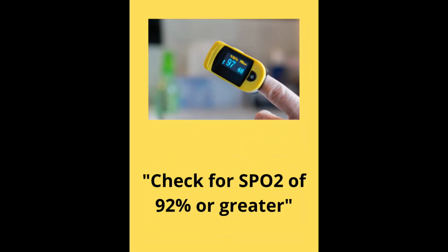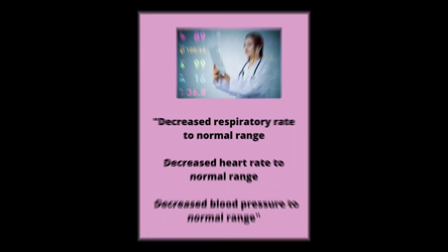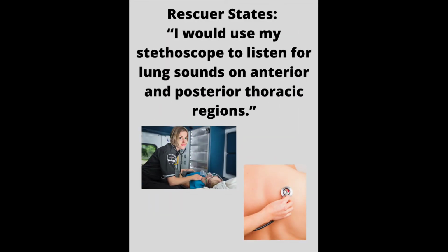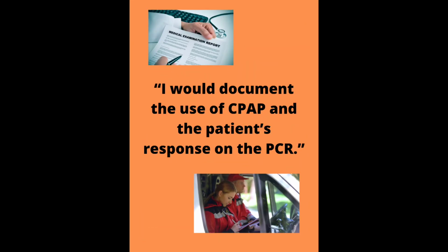SpO2 of 92% or greater. Decreased respiratory rate to normal range. Decreased heart rate to normal range. Decreased blood pressure to normal range." Rescuer states, "I would use my stethoscope to listen for lung sounds on anterior and posterior thoracic regions." Rescuer states, "I would document the use of CPAP and the patient's response on the PCR.